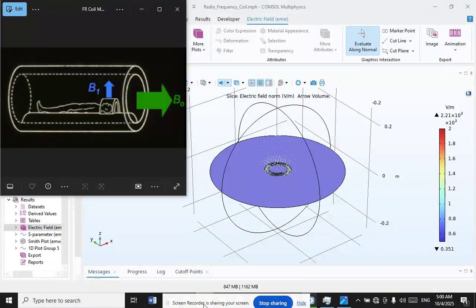Thus, the high-powered electromagnetic field produced in the MRI transmitter coil doesn't produce much electromagnetic radiation at its radio frequency, and the RF power is confined to the coil space and not radiated as radio waves. Thus, the transmitting coil is a good EM near field generator at radio frequency but a poor EM radiation transmitter at radio frequency.